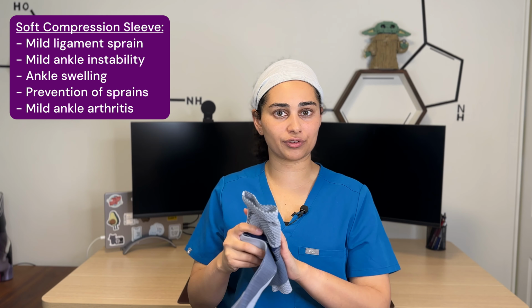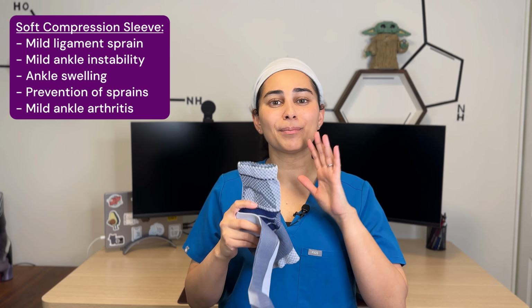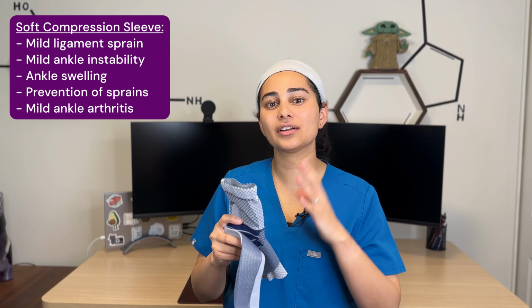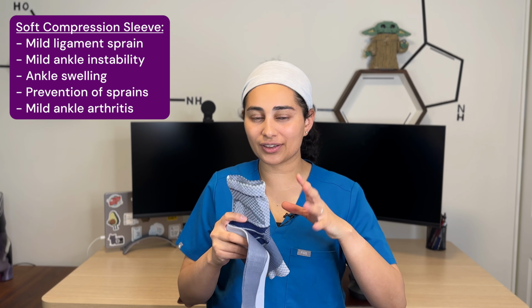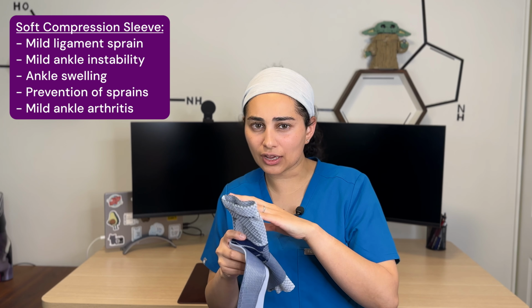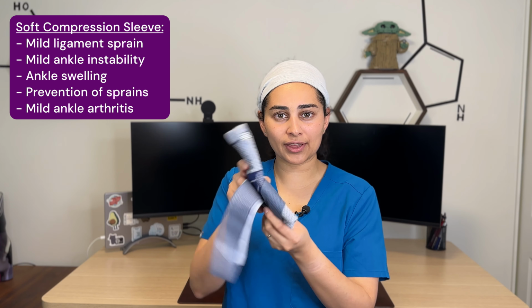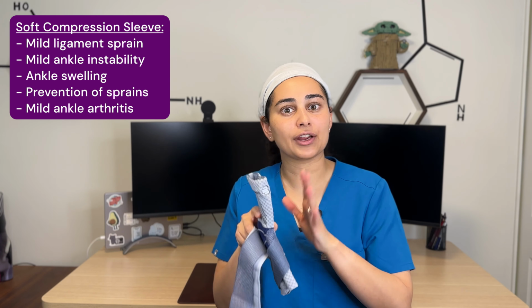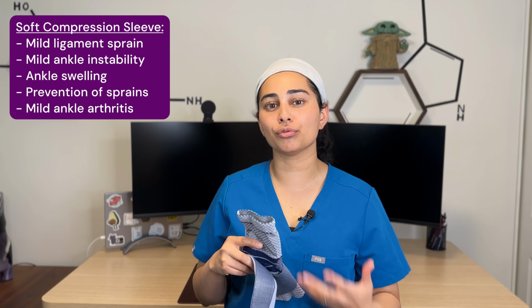What do we use this brace for? So this brace is used in mild ankle instability, some mild ankle arthritis, and some mild ligamentous injuries. So think a mild medial ankle sprain, a mild lateral ankle sprain. This helps provide that ankle stability so that you're not rolling out or in your ankle too much. The other thing that this is really helpful for is if you have any swelling in the ankle, this compression sleeve will also help take out the swelling, which can also improve your healing times.